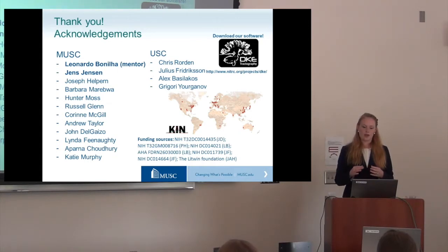So what we did is we actually made one big data set to do the tracking in, using all the data we had on that person to improve the tractography, and then used the microstructural measurements along it back at each time point.